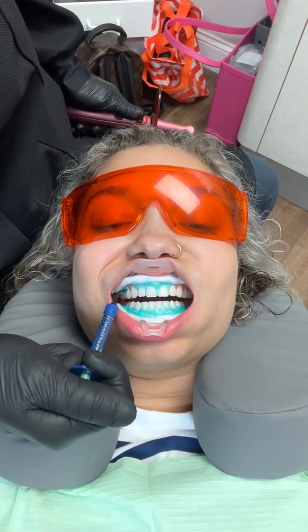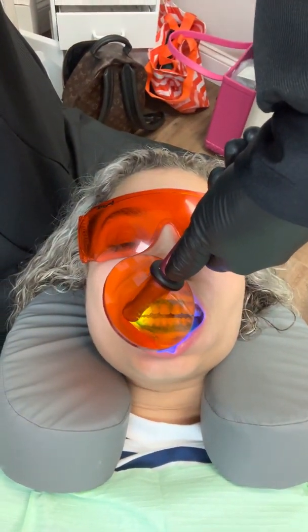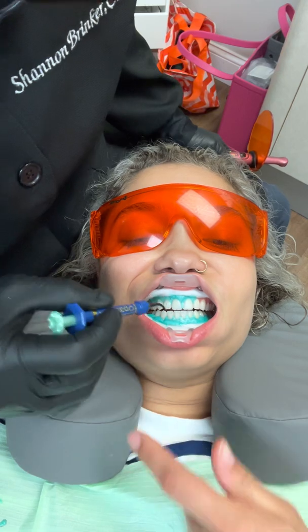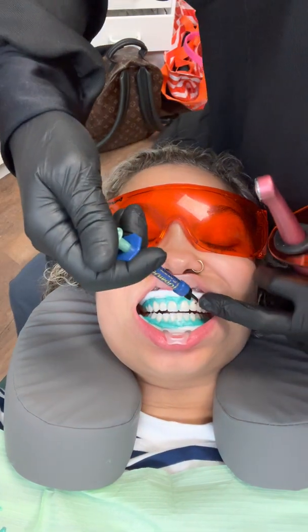Is it hurting you? Okay — just this area, the light? Okay, almost done.